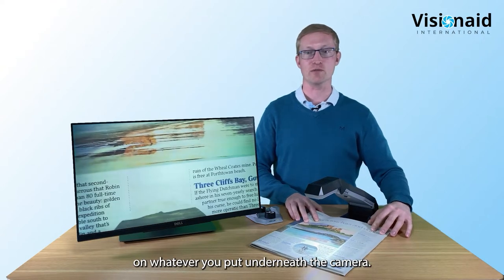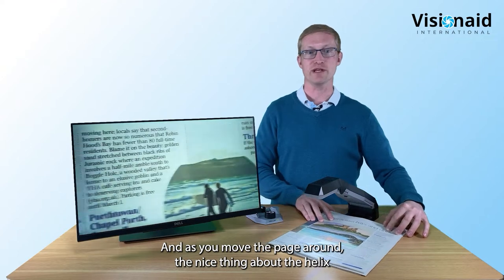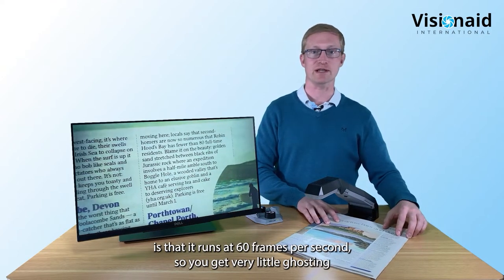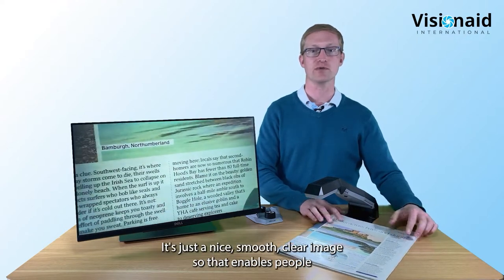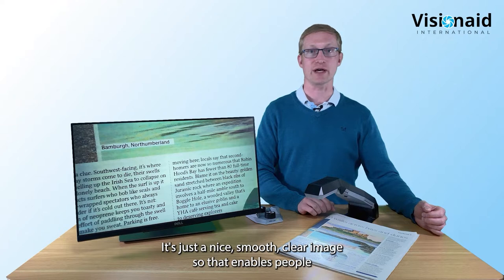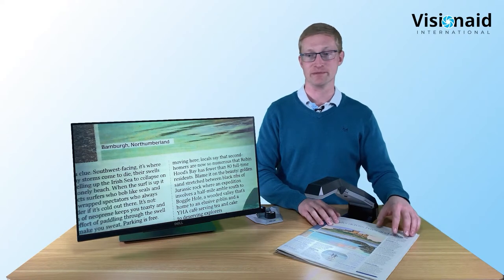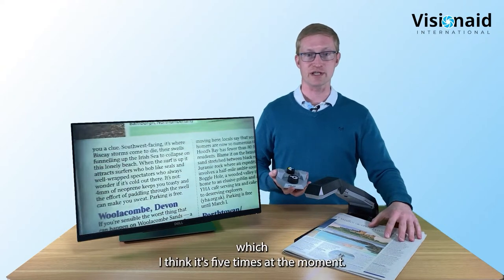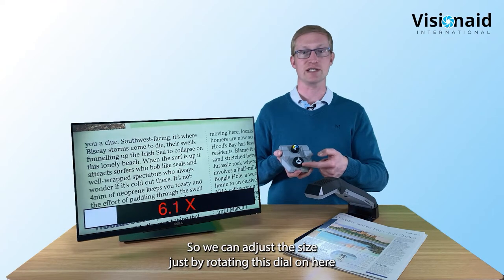As you move the page around, the Helix runs at 60 frames per second so you get very little ghosting or blurring - it's a nice smooth clear image. That enables people to read more comfortably and for longer periods. This is just at the default magnification of about five times, and you can adjust the size just by rotating the dial clockwise and anti-clockwise.